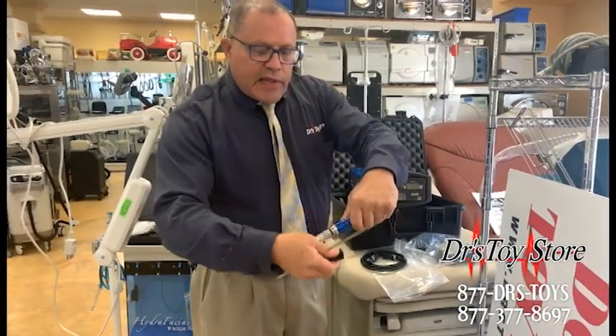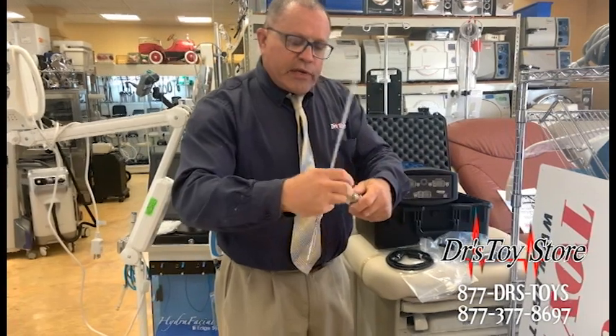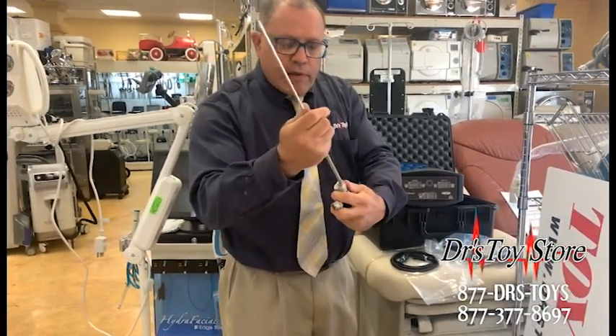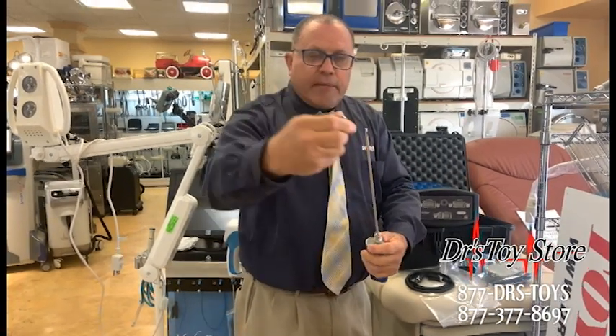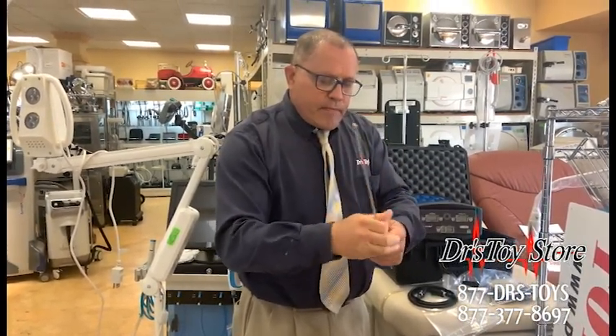This is the hand guard, skin guard. What you do is take the cannula, unscrew this little nut here, then slide it right in here. Take the nut, put it right over it, screw it on — good to go.